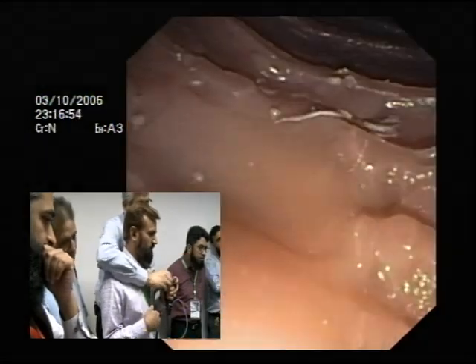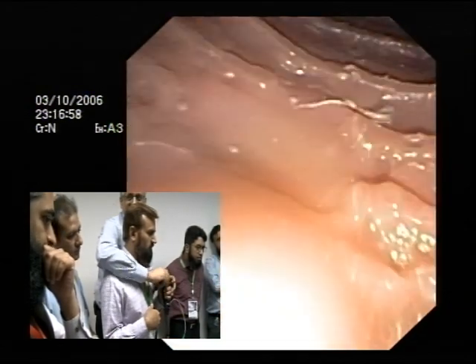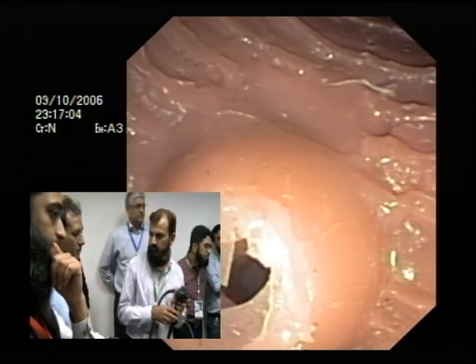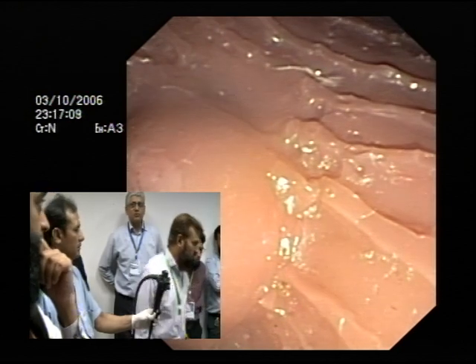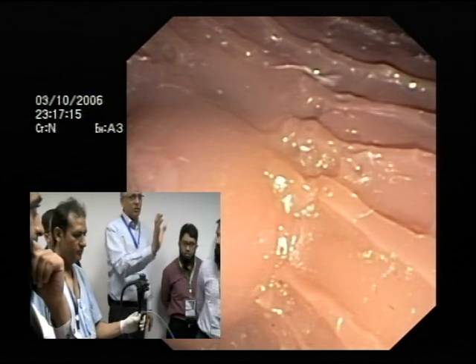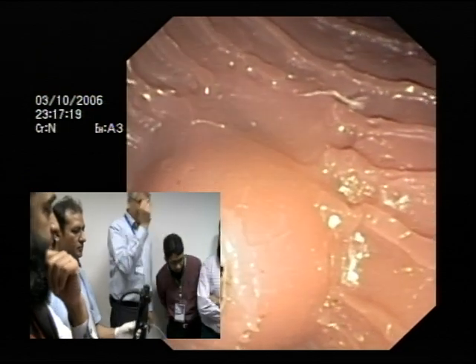Right position. Now I've got it right where I want and I'm using my big wheel to bring it back and forward. The distance we hit the ball is not by the power we use, it's the quality of the training. I think it's a very important point Vakar has made. It's very important to spend a few seconds looking at the ampulla. After you position it, have a look. See where you want to cannulate, and then go.